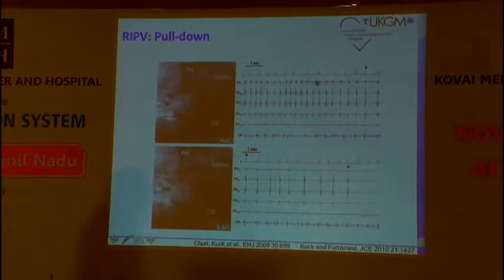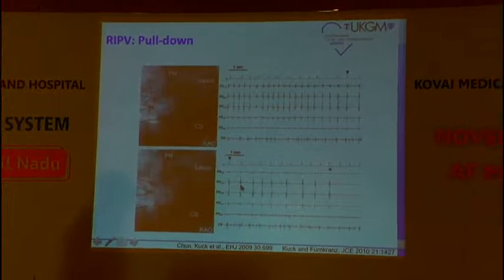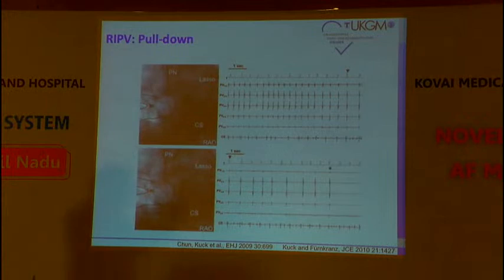And we start with the freeze. And what you see here, the signal within the pulmonary veins gets slower. It gets slower and slower and slower. And then at the end, it disappears. And once it disappears, we know the pulmonary vein is isolated. If there's really 100% transmurality, only God knows. We do not know. This is the acute outcome.